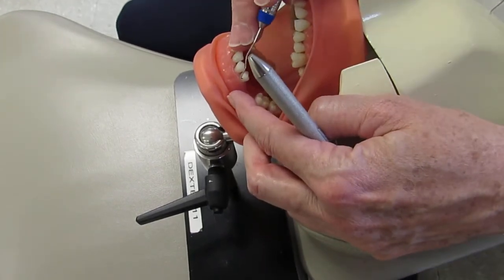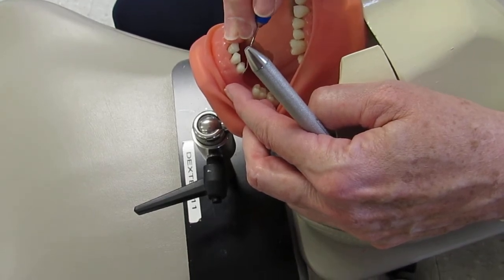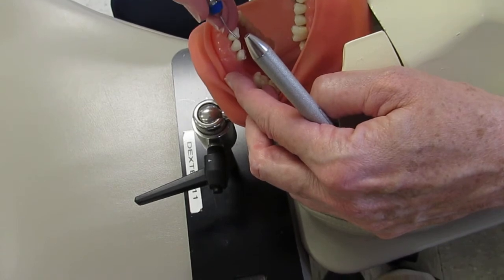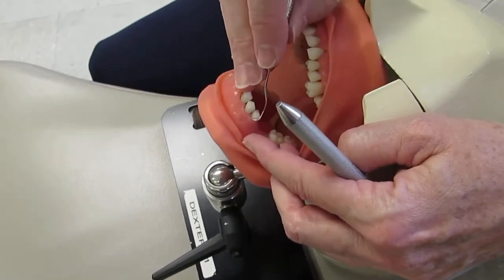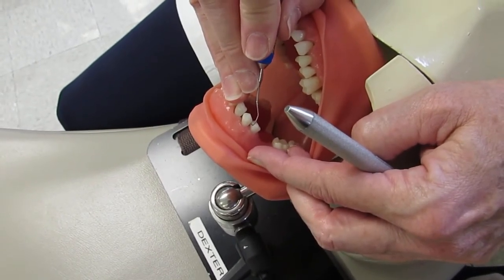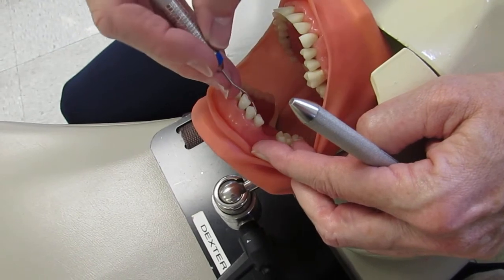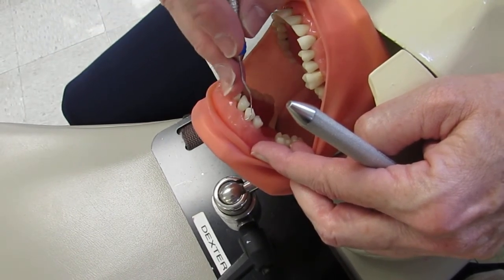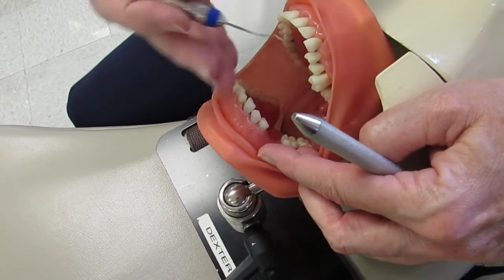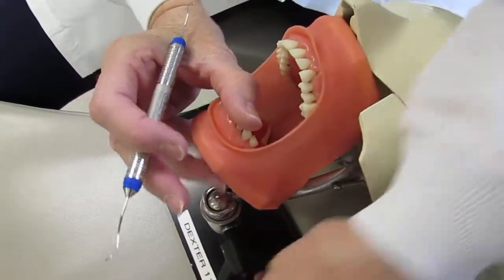On the next tooth, insert and go only halfway across. Come out, quarter turn, then go to the opposite lateral side on that tooth. To do the lingual, flip to the opposite working end and change clock position again.